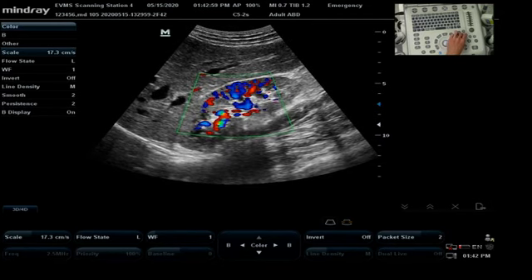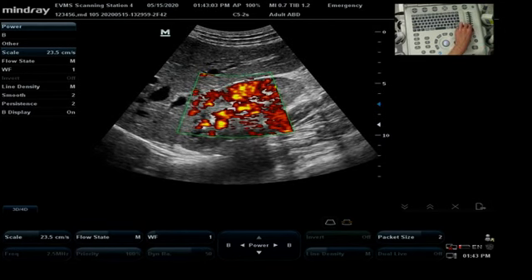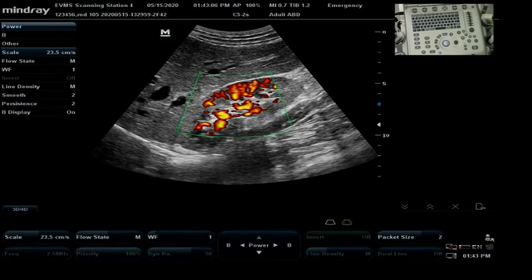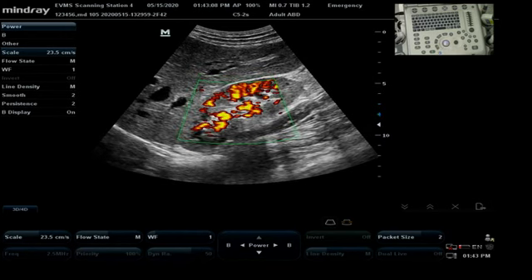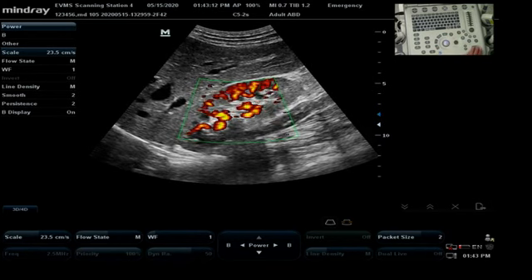I'm going to now contrast that, starting with color Doppler with a 2-color map, and I'm going to now select the button that says power. Now we have Doppler, but we have 1 color scheme. It's all a solid color scheme, and that's how you can tell them apart. Now these are quite different tools, and they have different strengths.